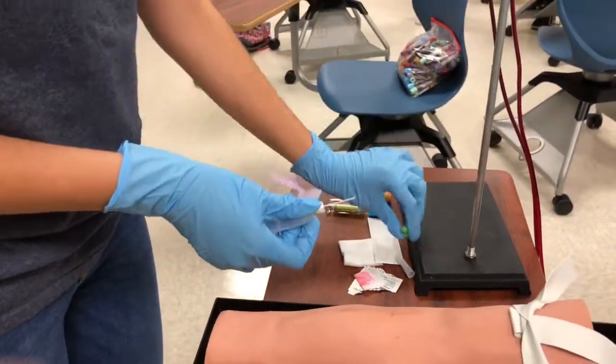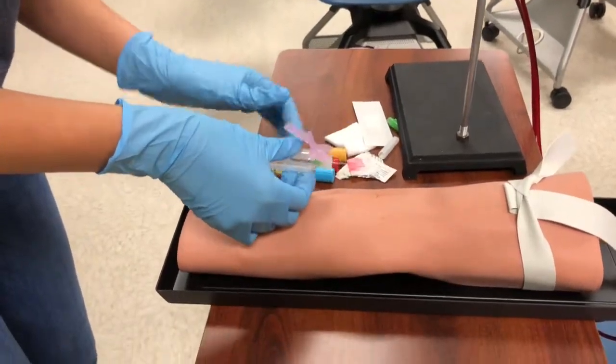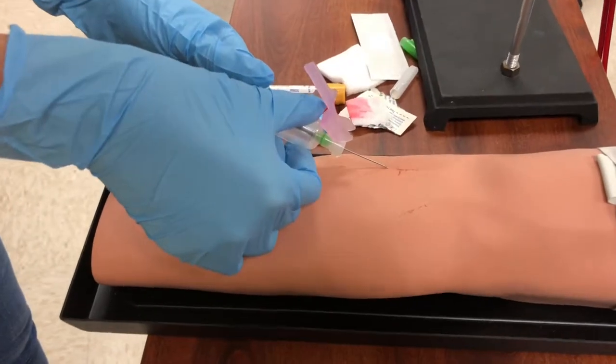Now I uncap my needle and get ready to perform the venipuncture. I make sure my tubes are right by me so I'm not crossing over during the venipuncture. I put the needle in at an angle.